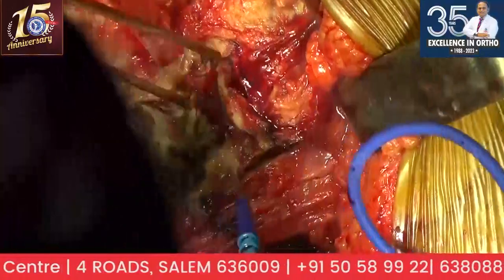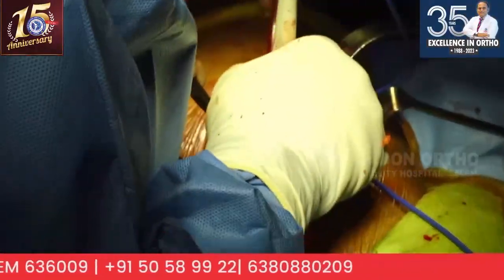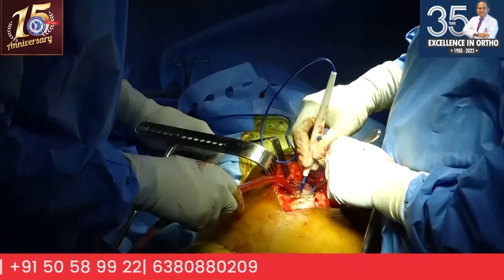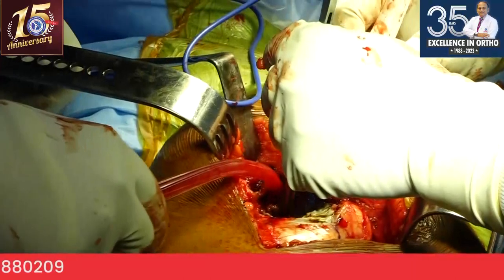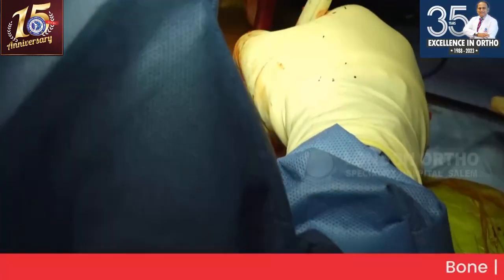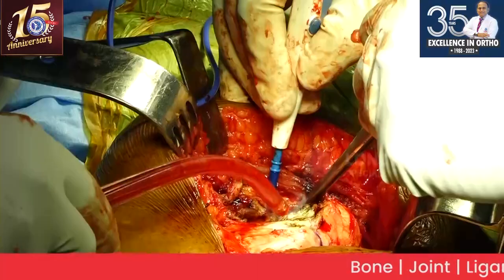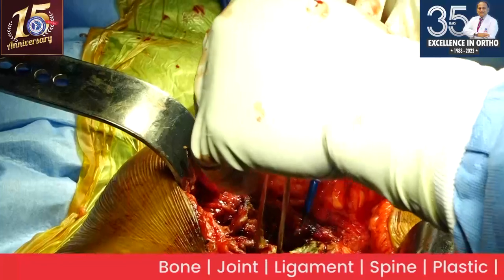You have not touched the vastus lateralis? No, I don't touch the vastus lateralis. You don't need to. This is a dysplastic hip, so I may have to do some release, but in my routine hips, definitely I don't touch it. So now, okay.